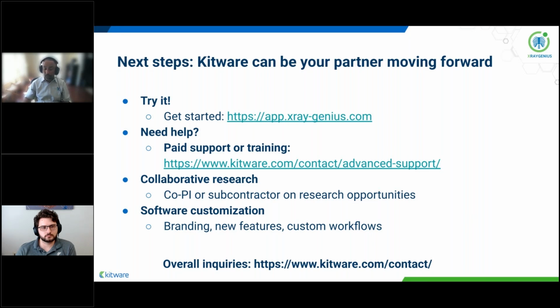So X-Ray Genius can be deployed on public cloud, or it can be deployed on-premise, on local workstations, and we can help with that as well.